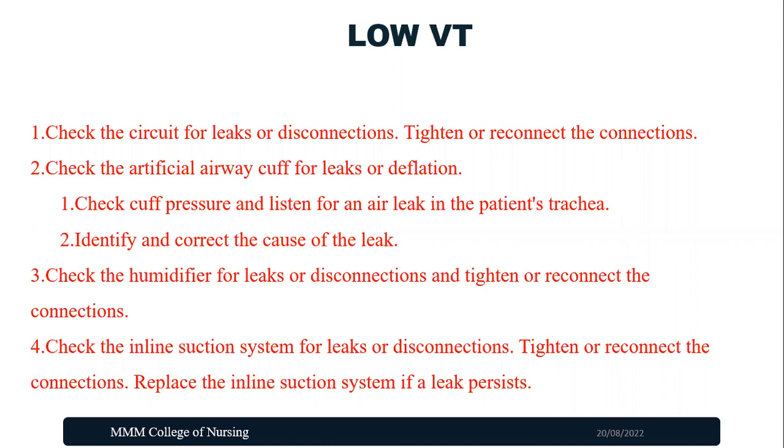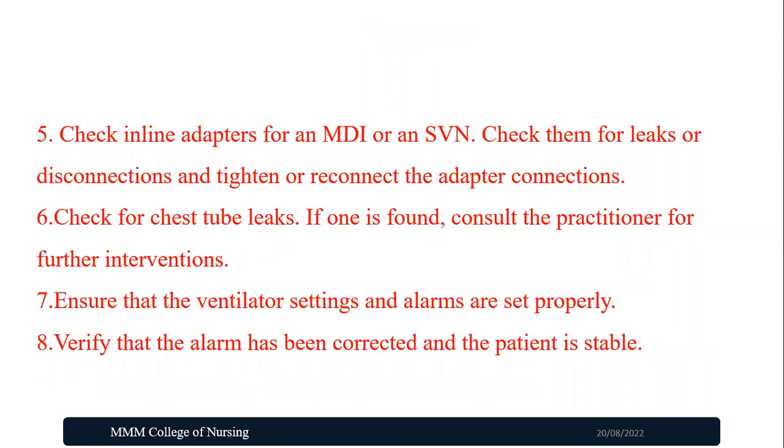Check the humidifier for leak or disconnection. Check the inline suction system and the small volume nebulizers. Check the chest tube. Ensure that the ventilator settings and alarms are set properly. Then after verifying everything is corrected and the patient is stable, you can leave that patient.